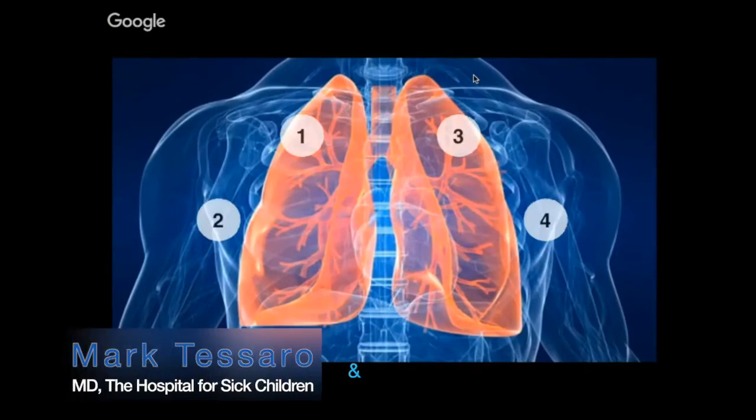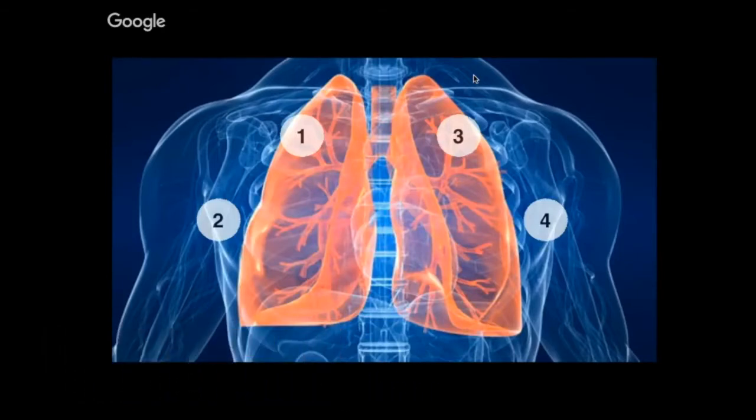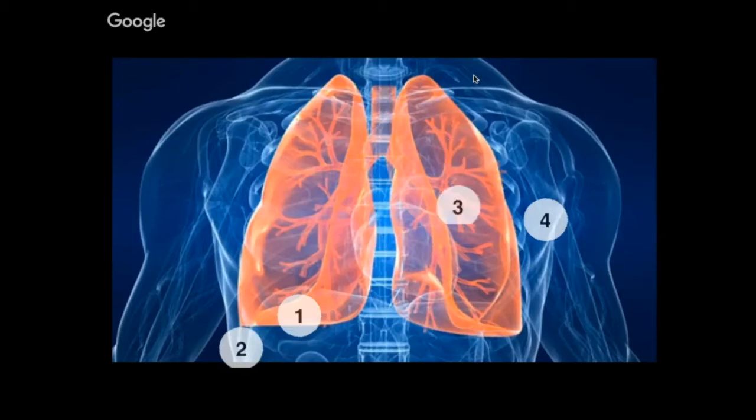Scanning technique — what most people refer to as a screening exam — involves using your probe in a longitudinal orientation, often starting up by the clavicles as one limit of the chest, then dropping the probe down until you hit the diaphragm and the solid organ. People will start at the clavicle, drop down one side, go as high as they can in the axilla, then take a mid-axillary approach and again drop down to the diaphragm.